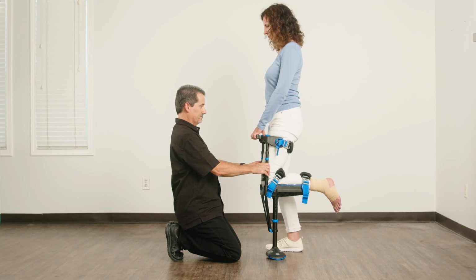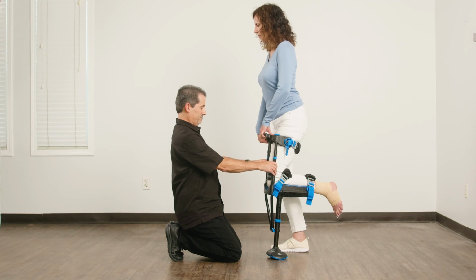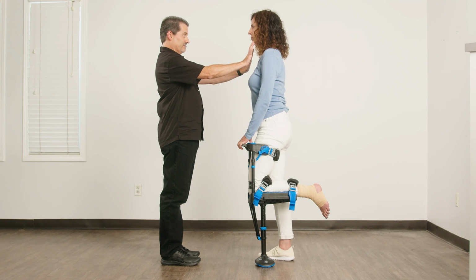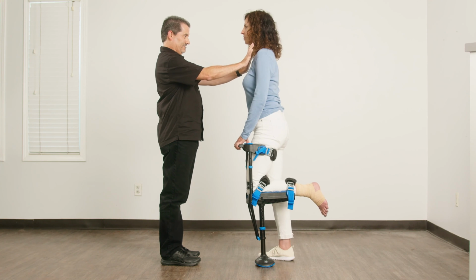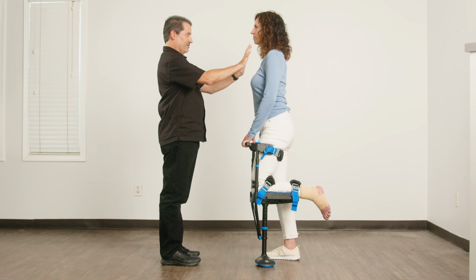It's not uncommon for the patient to remain in an erect posture and merely poke their foot forward in a simulated step. The correction for this is the same. Place your hand in front of their upper chest and instruct them to lean forward and bring their upper body to your hand before they initiate a step. When they do this, they will naturally step forward with their good foot.